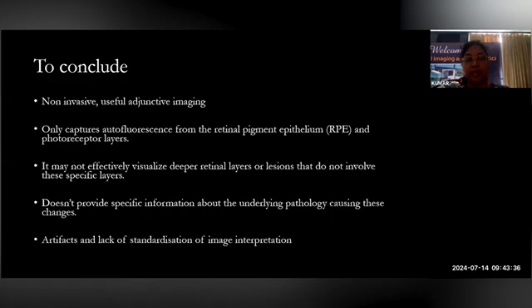To conclude, autofluorescence is a non-invasive and useful adjunctive imaging. Like in areas of AMD, to rule out foveal involvement, we do need an OCT and visual acuity and a clinical correlation. Autofluorescence only captures from the retinal pigment epithelium and the photoreceptor layers. Any involvement of other layers is very difficult to diagnose and understand in autofluorescence.